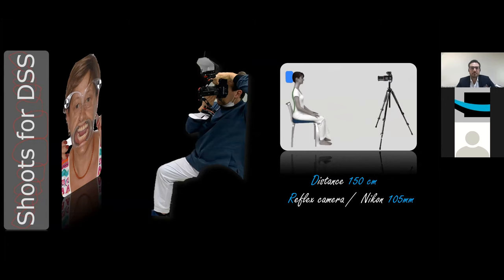We studied this first step of our workflow in the past 3 years, and we know that we must use a reflex camera during our activity. We have to take images at a distance of about 1 meter 50 centimeters, with a particular objective lens. So I invite you to check this information, because I think it's important.